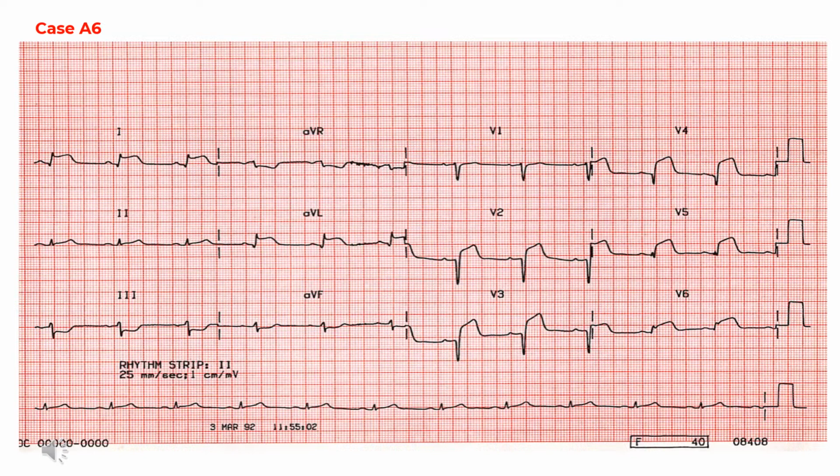Comment. The ECG shows evidence of extensive anterolateral infarction, and the clinical findings are certainly compatible with left ventricular impairment resulting from this.